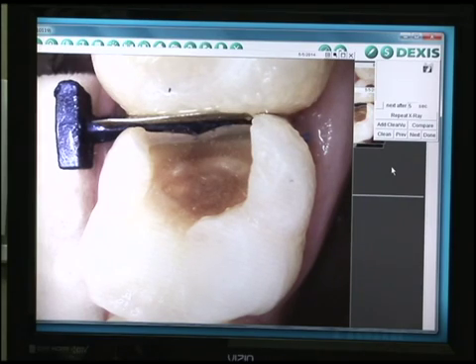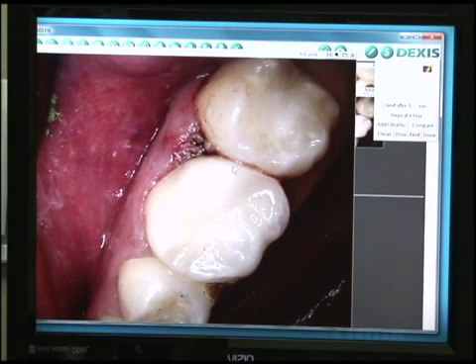This was a case where a young lady had a very damaged tooth with a very big cavity, deep decay in the tooth, and it was very close to needing a root canal. But we were able to prevent her from having a root canal, and we actually used the Cerec technology you just saw to restore it back to normal. And so this is an actual example of an actual patient who had a severe dental problem that we were able to restore and fix with Cerec.